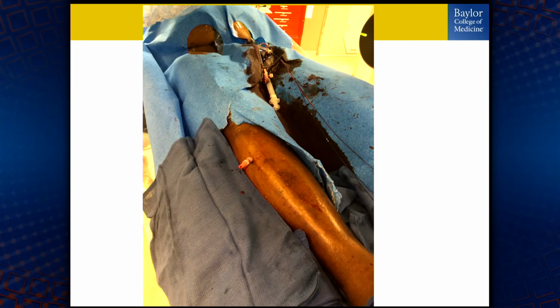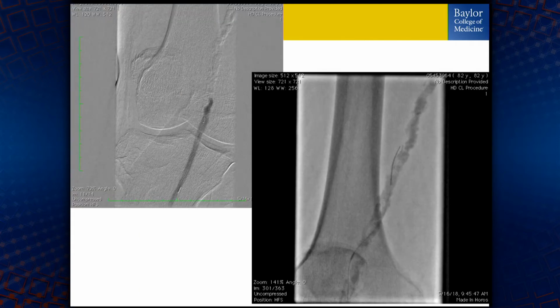This is what it would look like from the outside. The reason why the whole leg is out is I am a vascular surgeon, and my people like prepping legs because I don't know where I'm going to poke. I could poke high up, at the ankle, behind the knee, so they prep the entire leg as if we're going to do a bypass from the groin circumferentially all the way down. So I just cut the drape wherever I need to access, and it immediately improves the workflow.